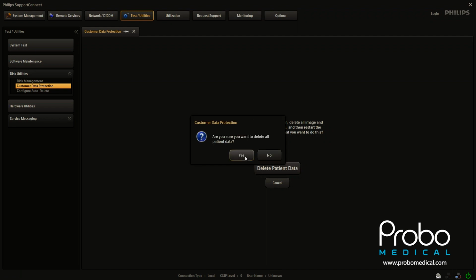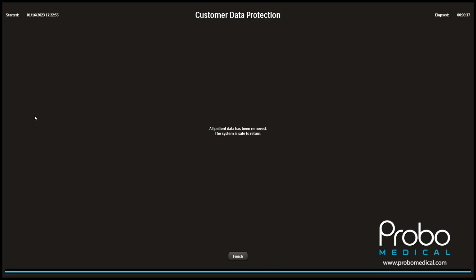Once you do that, it's going to confirm back. Do you want to delete all patient data? And we say yes. Process has all gone through the entire length of what it needs to go through, and it's deleted all the database and everything. You will get a finish button. Just go ahead and click the finish button. And the machine will actually reboot. Let it reboot and you're good to go.